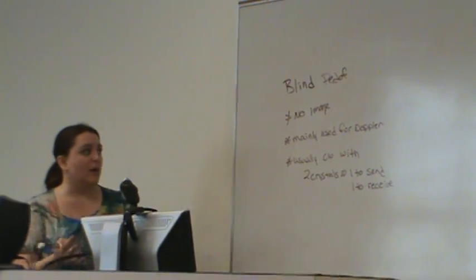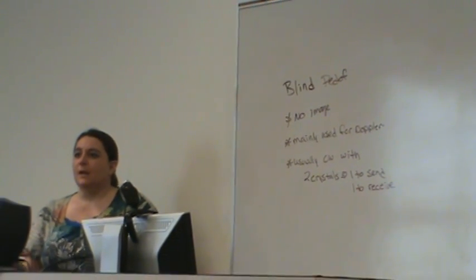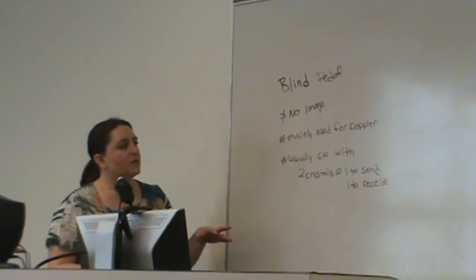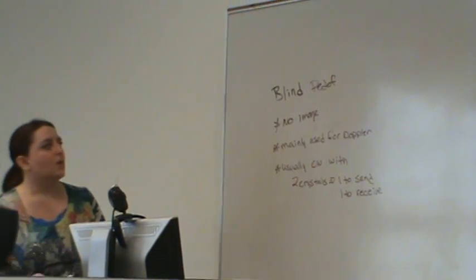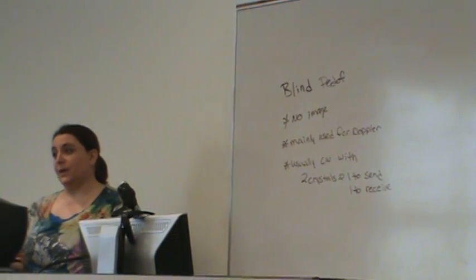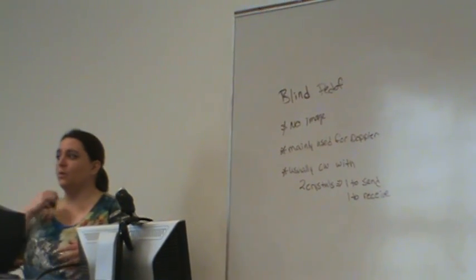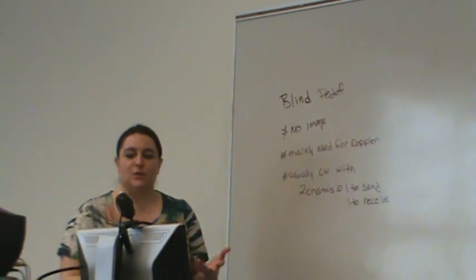This was kind of the original idea behind a lot of the uses for ultrasound: okay, we have this crystal that we can send this wave in and we can get something out of the body, but we didn't really get many images with it. So this is still in use today for these Doppler purposes, but other than that, you're not going to see it. The downsides of this were, first, it didn't have an image, so we needed to figure out a way to get an image. And second, we didn't have a way to steer it through the body. You hold it in place, you'd have to move it around a little bit, but we couldn't steer it through a volume and actually create an image out of it.